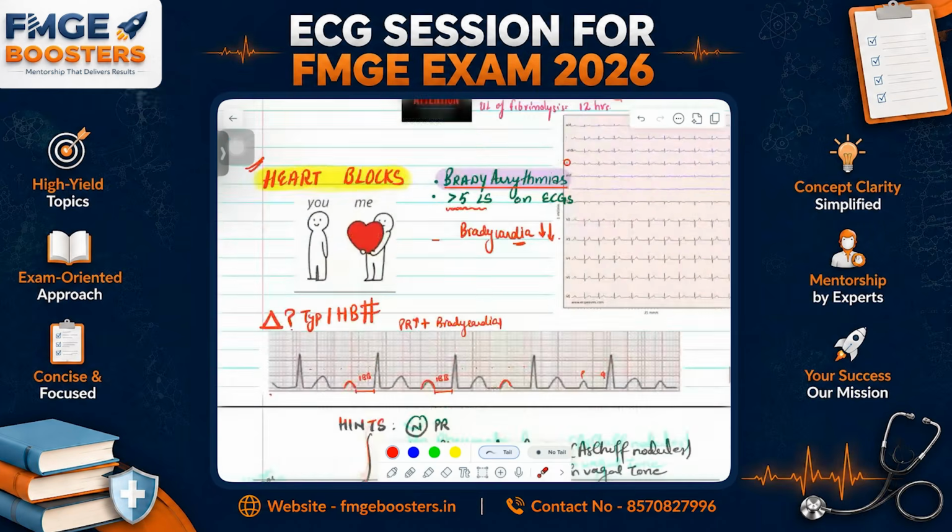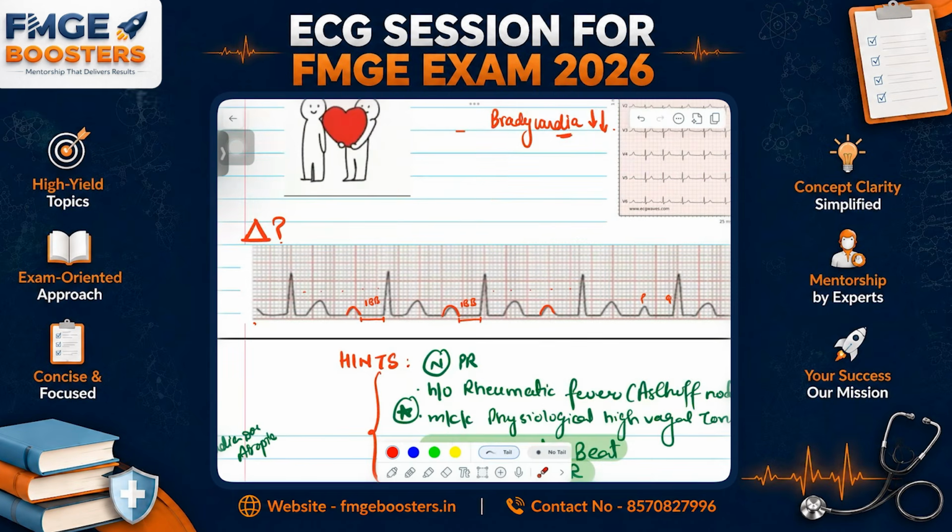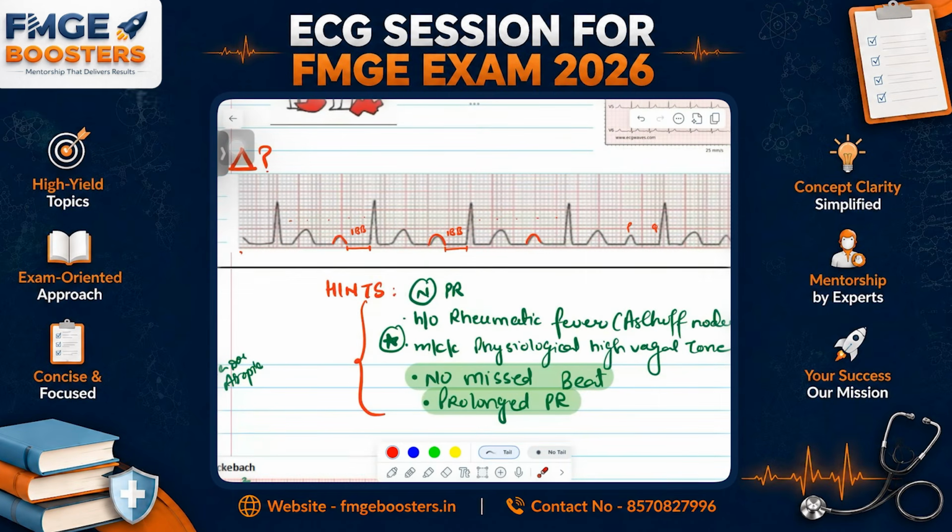Okay, let's start with this now, guys. It is a type of heart block. Now just tell me one thing, what do you appreciate here? Is it brady or tachy? First of all, tell me sinus or non-sinus, brady or tachy. Yes, it is bradycardia. This is sinus, right? P is present. Bradycardia. And the third one was what? It was regular, non-regular, irregular, right? It is the kind of regularity.